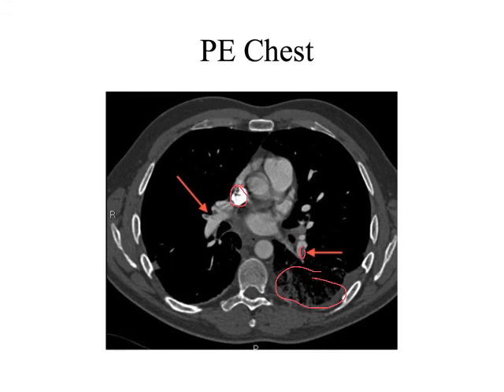Nevertheless, we want to be very careful about how we trigger these exams, that we place the ROIs appropriately. Sometimes due to patient motion, I've seen the ROI slip and land on the sternum, and it triggered early because of the patient movement, and then we did not get adequate contrast because it triggered too soon.